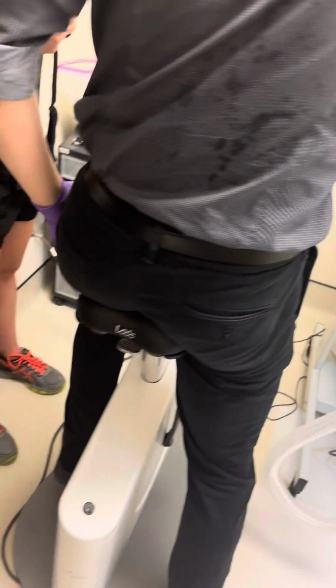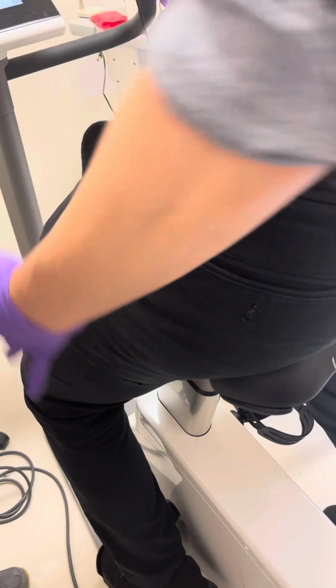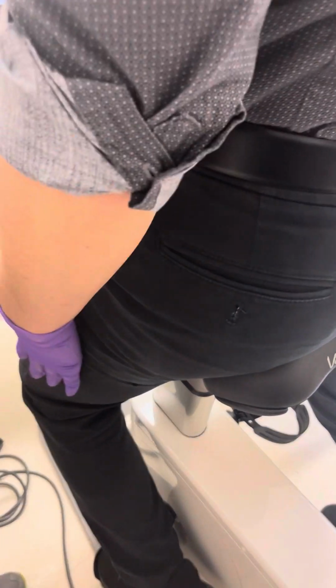So when the subject is at the bottom of a revolution, there has to be a certain angle to the knee, and that's what you're going to have to look out for. So you should do this before proceeding with the test, just to make sure that the seat height is good.